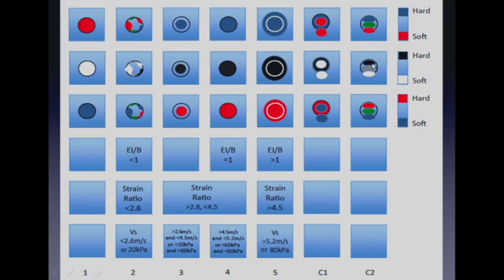Or on some manufacturers it shows up as this blue, green, red, or BGR signal. I kind of gave that as a cyst 1 and a cyst 2. And again, that just varies based on the manufacturer. But this is a very useful sign in determining something is cystic with very high sensitivity and specificity.